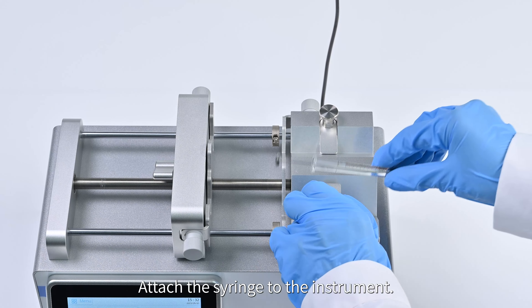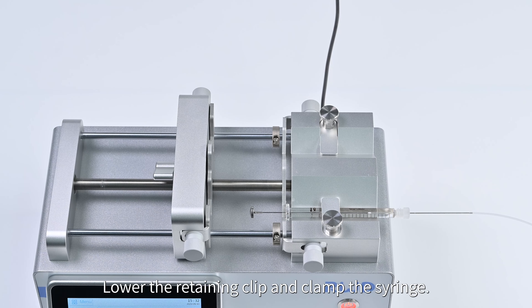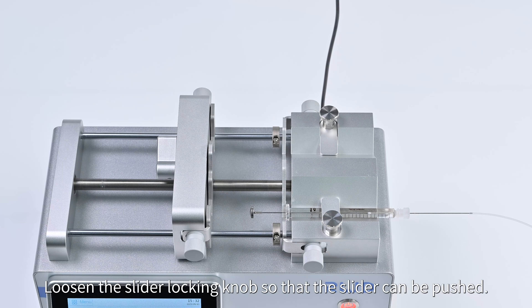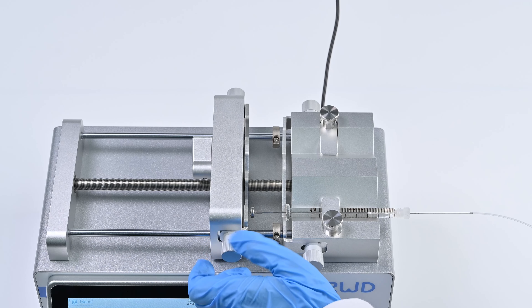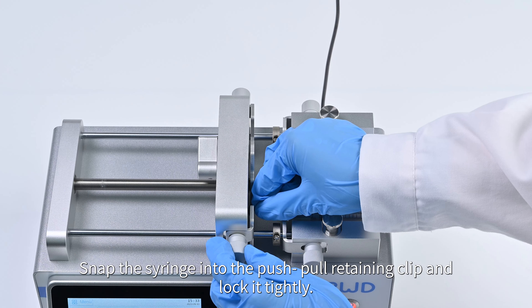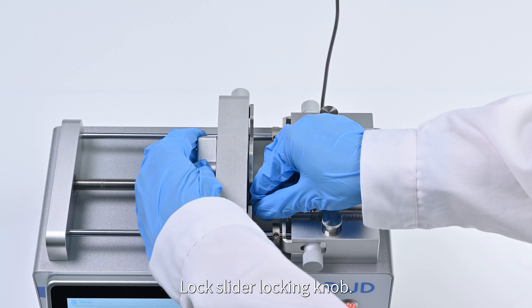To attach the syringe to the instrument: lift the syringe retaining clip, place the syringe into the V-shaped groove, lower the retaining clip and clamp the syringe. Loosen the slider locking knob so the slider can be pushed, then move the advanced slider according to the syringe position. Loosen the locking nut, adjust its position, snap the syringe into the push-pull retaining clip and lock it tightly, then lock the slider locking knob.